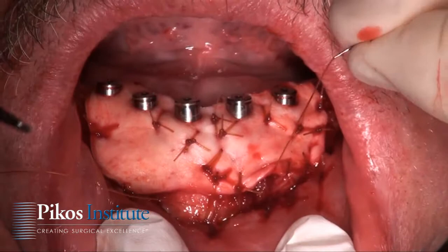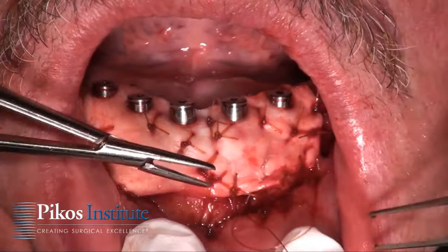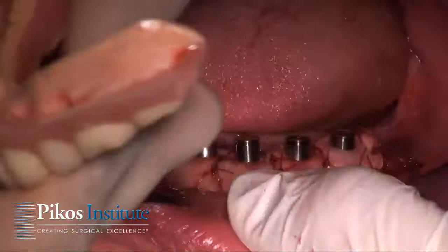The ADM — AlloDerm here — has a fairly tough, rubbery, matte consistency. In essence, we were able to core out the B and D position site so that the denture will be able to be seated directly over the abutments.